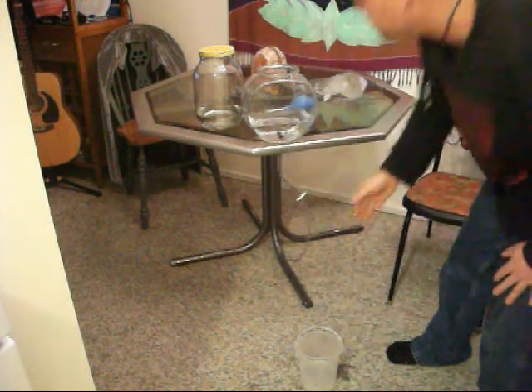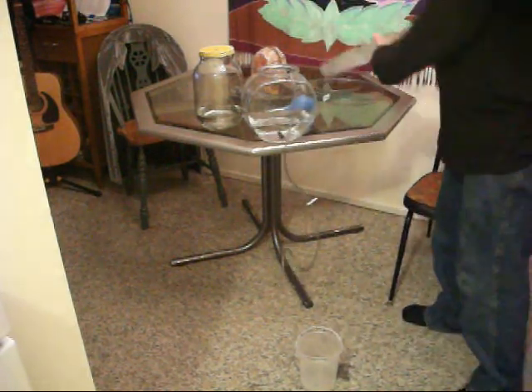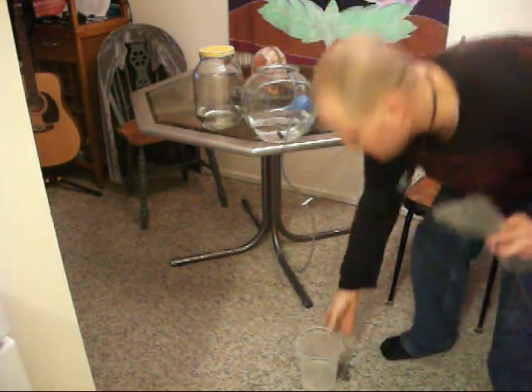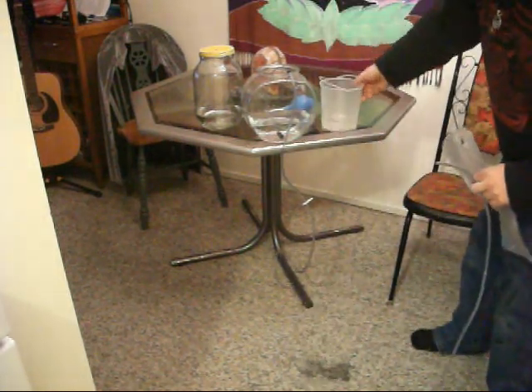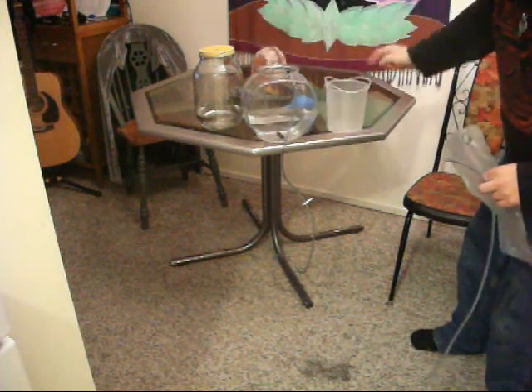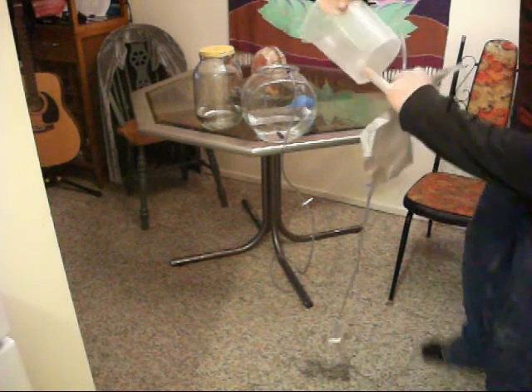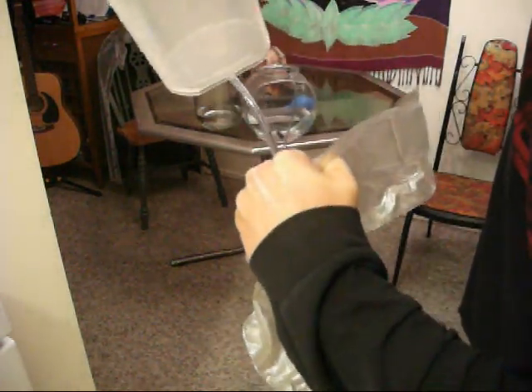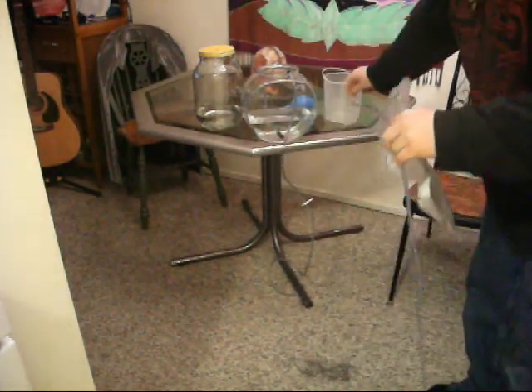It's really cool because you can make it for cheap. These enema bags here, this is what it comes with. These enema buckets come with not only the bucket, but this little piece here, as you can see right there, this clips into there. So that's the normal plastic version.